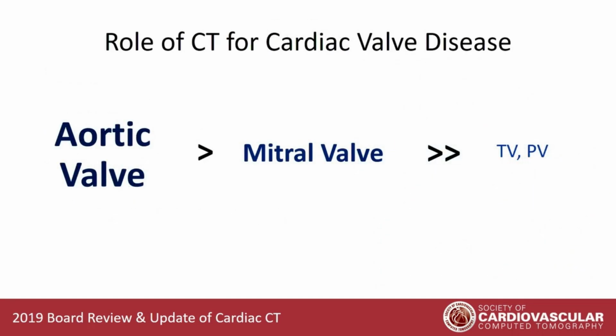So when we think about the evaluation of cardiac valvular disease using CT, you can think of it as a schema like this. The aortic valve is huge, right? Of course, you're all well aware of the revolution in TAVR that's occurred and is largely enabled by CT evaluation of the aortic valve. Following somewhat closely behind the aortic valve is the mitral valve. We're starting to do more CT of the mitral valve for evaluation, in some cases for planning of a transcatheter mitral valve prosthesis, but just honestly in general terms for the mitral valve.